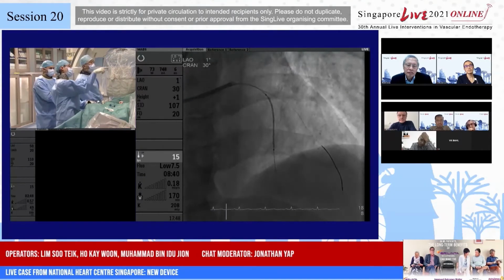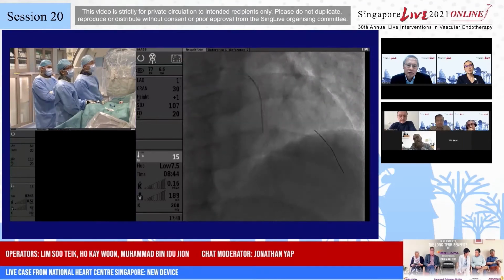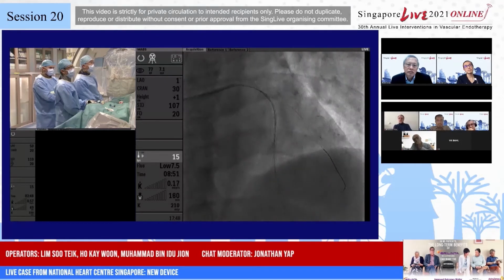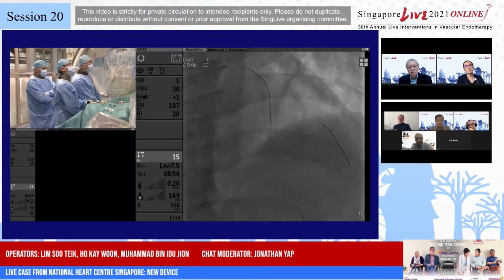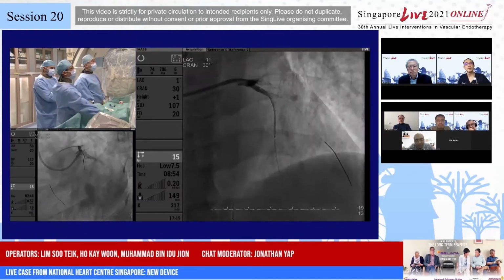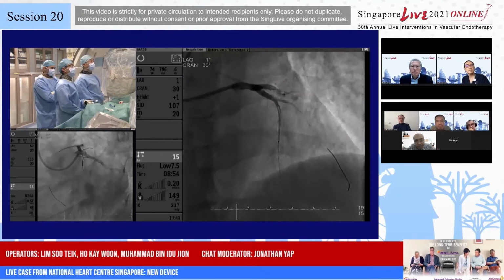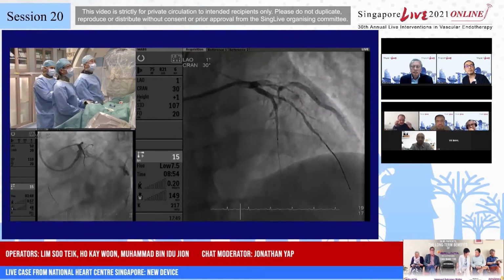Shall we try? Maybe what we'll do is this. When we measured earlier, it is at the upper limit. So we just covered the tightest part. Proximally, we are beyond the diagonal. 8 millimeters, just cutting it if we do need the port. We're stretching the limit a little bit.